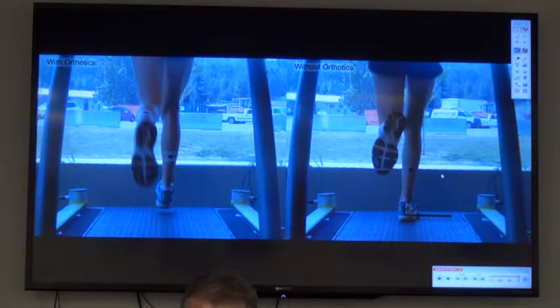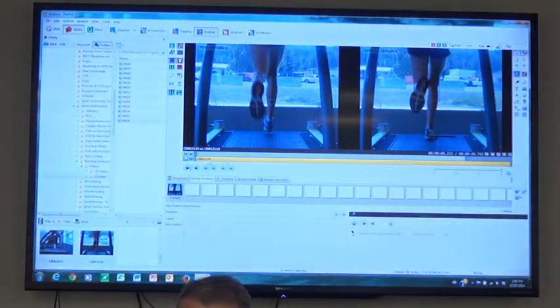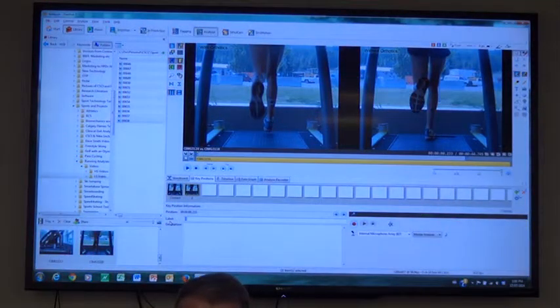So the difference between the contact, the 80, and the 94.3, I would call that motion towards pronation. But her pronation itself too is at around 94.3. So remember that number, and then we're going to compare it to the with orthotics condition to see if she's actually reducing her pronation.